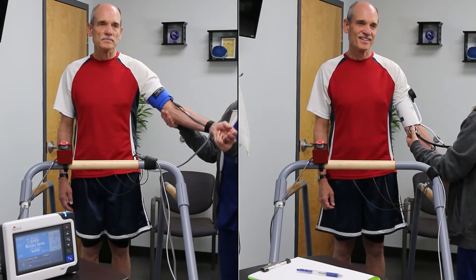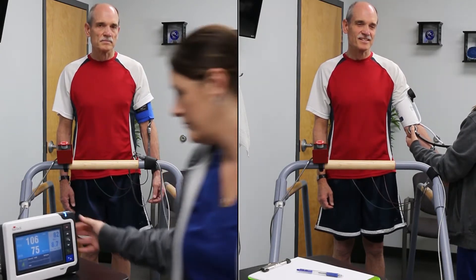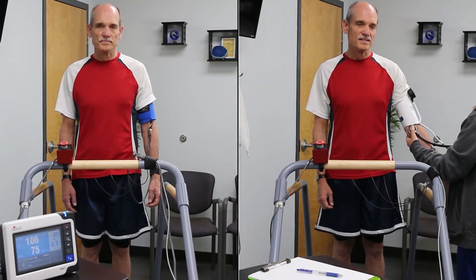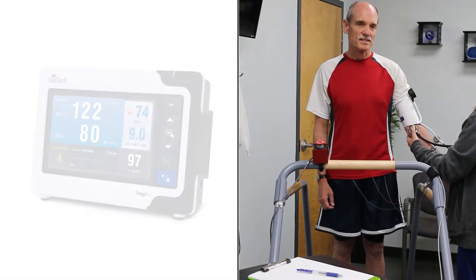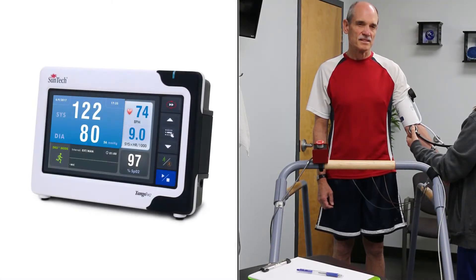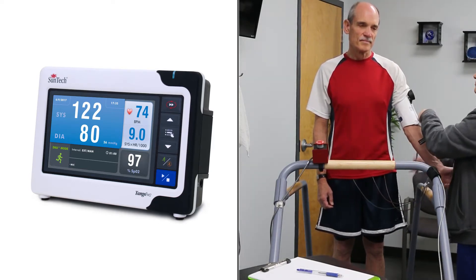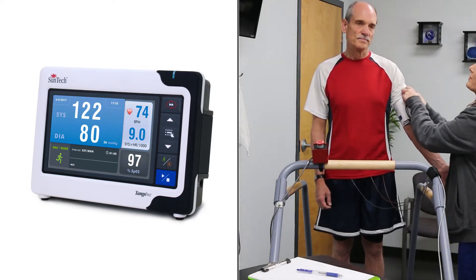On the left you'll see the Tango M2 and on the right you'll see the manual blood pressure measurement. The first measurement is a standing baseline BP. The Tango M2 interfaces with most stress systems to seamlessly transfer and record the BP data, which reduces the risk of transcription errors.